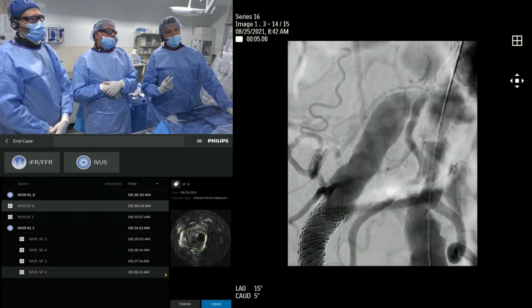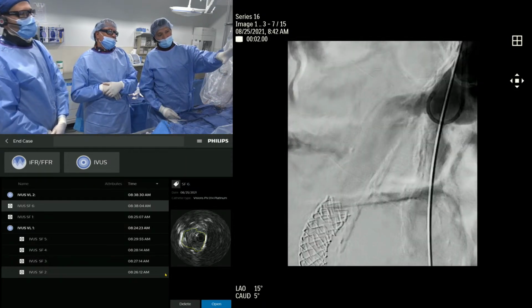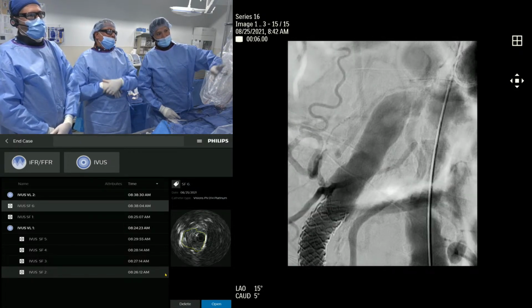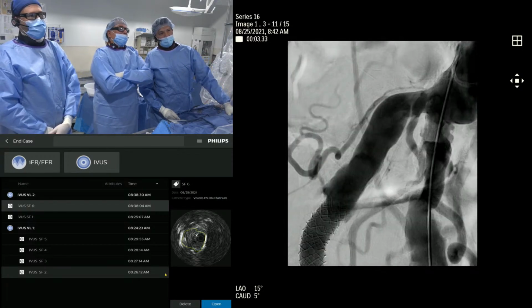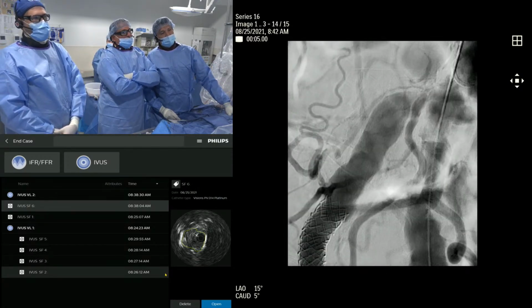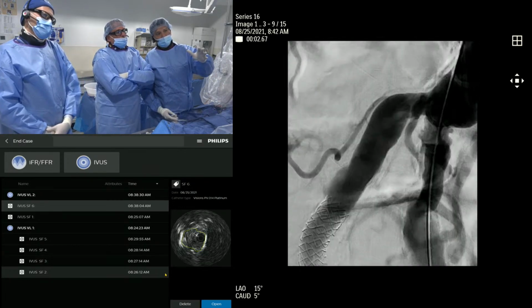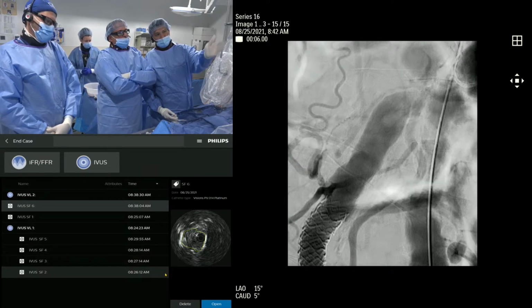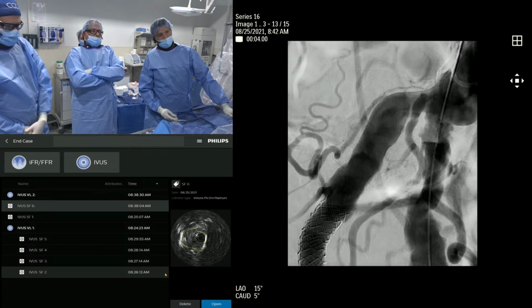Now I can see the angle. Also the biggest advantage we have is the opposite side, the contralateral iliac, is at least 11.0. Right, comparing to this side. I'm not worried about pinching the contralateral iliac. Yeah, I'm saying the aorta is. I'm worried about jailing the contralateral iliac, because remember, we have to go up and over. You're going to get one strut, which is probably what it's going to be, but the aorta is also big, and I think it's going to push more towards the aortic side because the pouch is more on the aortic side.